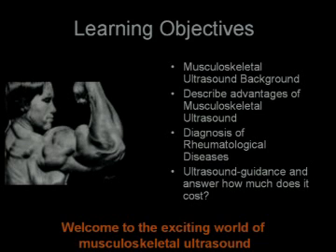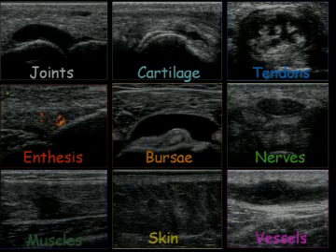It's been used as a European tool, but over the past 10 years, rheumatologists have been getting interested in it because of its utility and usefulness in practice, guiding injections and doing on-site diagnosis. So we're going to go through some cases. I'm going to show you what I do in clinical practice with ultrasound.